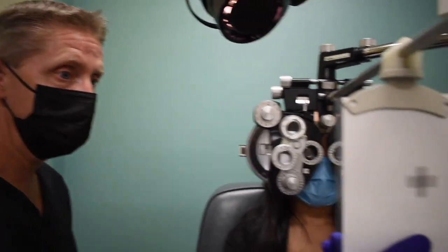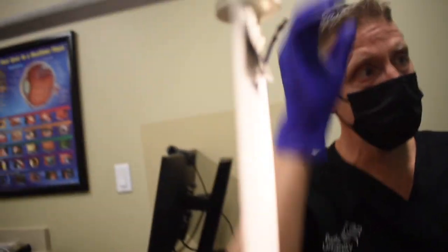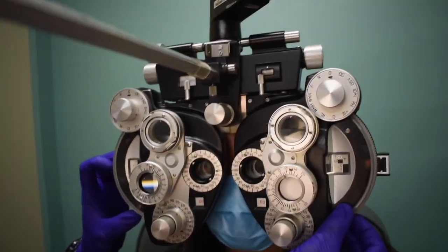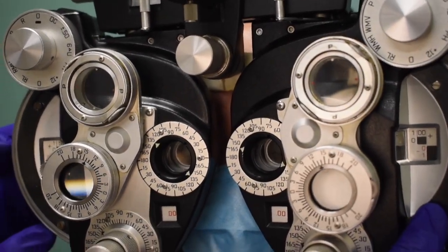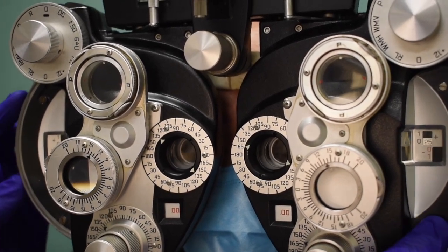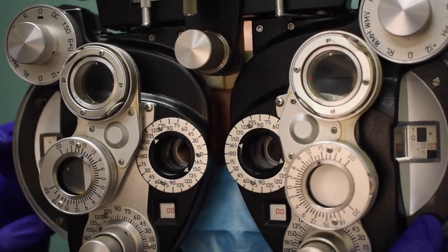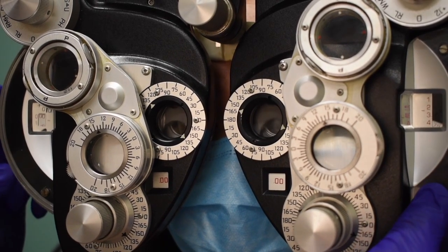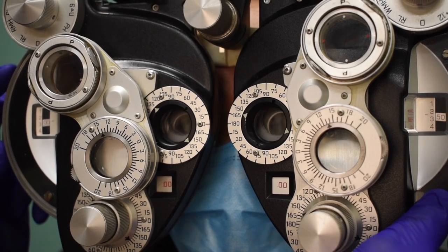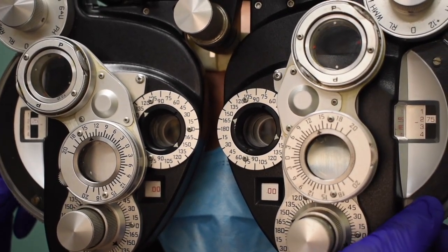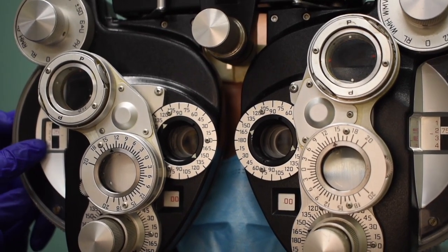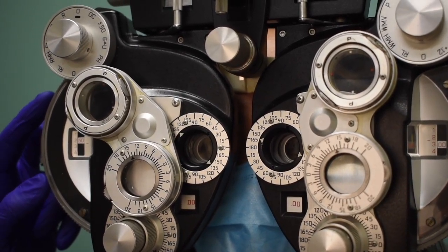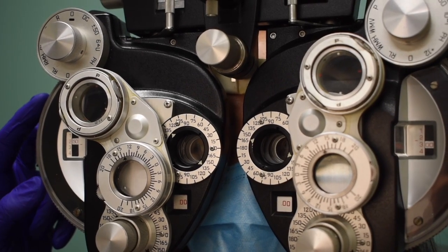The last thing we have to do is her PRA. So I'll rotate the lenses back in place. Put the light back on it. I've taken out the plus minus 50 cross cylinder. And now we're going to max out her accommodative effort. Phoebe, tell me when those letters get so blurry you couldn't read any of them. Here we've now hit three diopters net. So we are going beyond three diopters. Phoebe is still seeing those letters. So I would simply stop here and record greater than minus 3.00 net for her PRA and you're done.